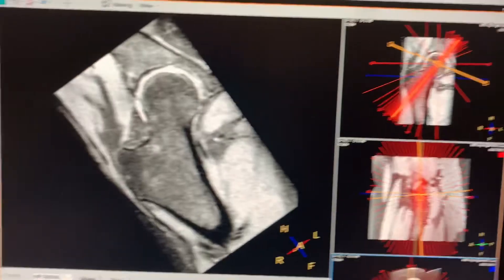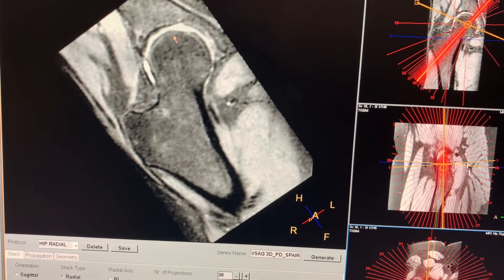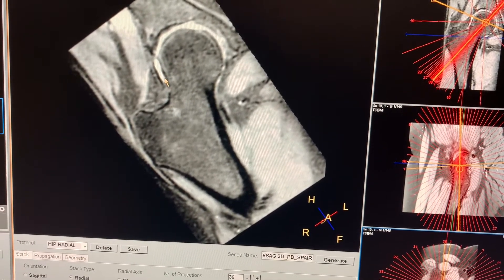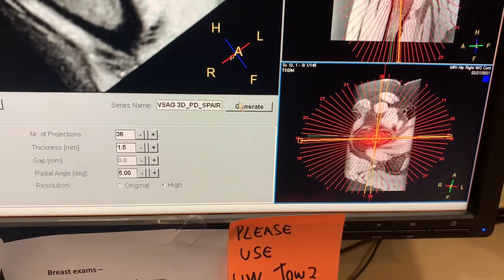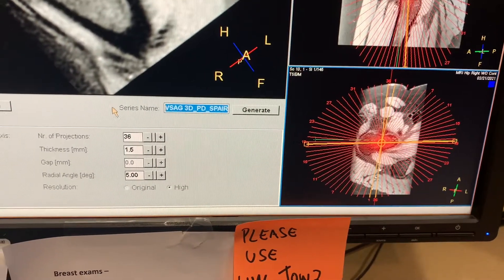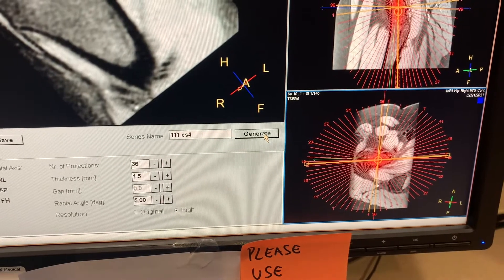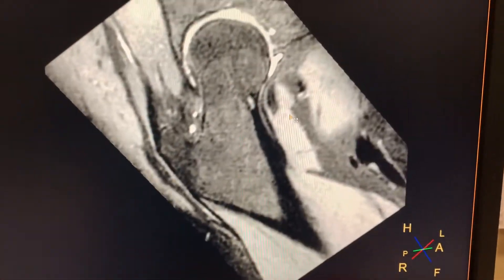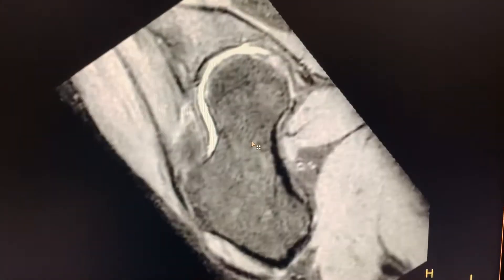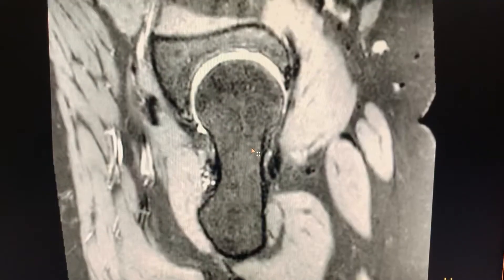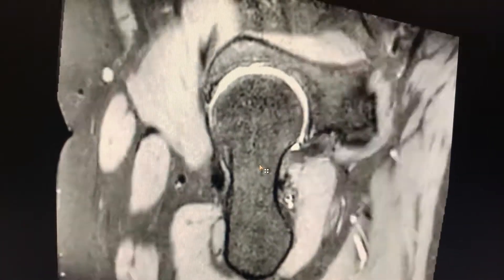Now you're ready. The image will look angled, which is fine — we're looking at the whole joint and the labrum space is straight up, which is what we want. Hit generate image, rename it if you like, then generate the 3D image. As you review it, the femoral neck should not be thickened or show motion at any point — you want it to stay the same thickness throughout.